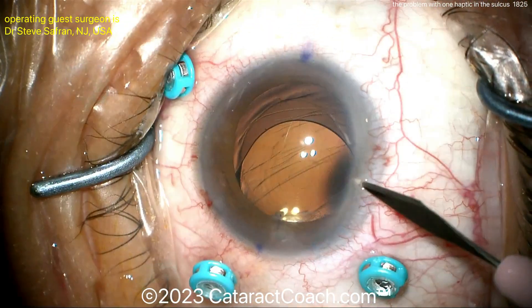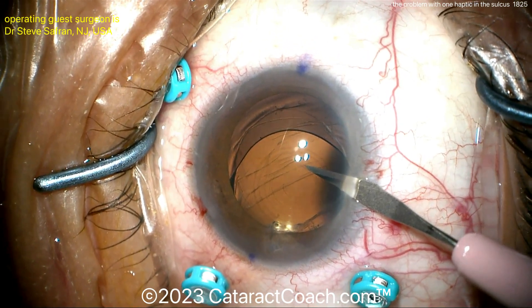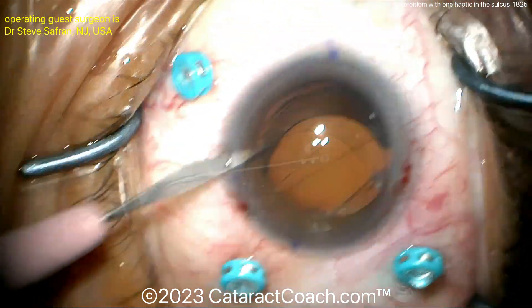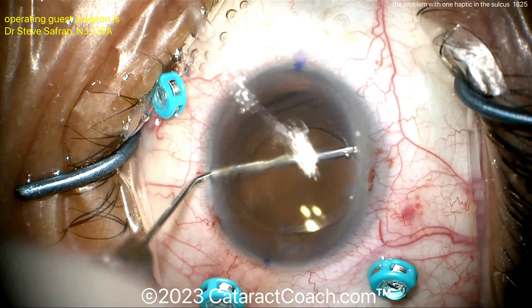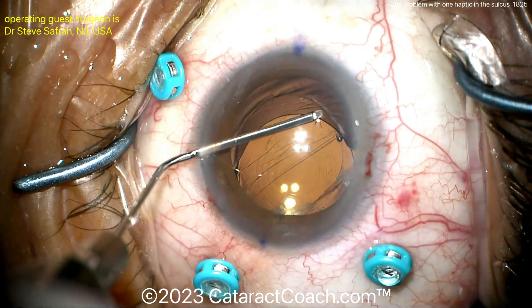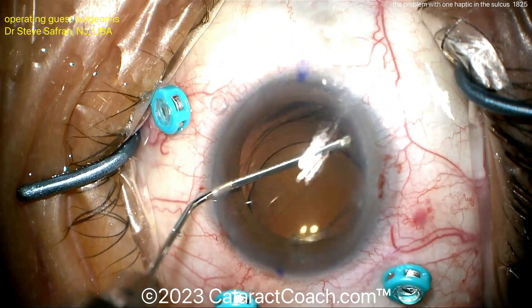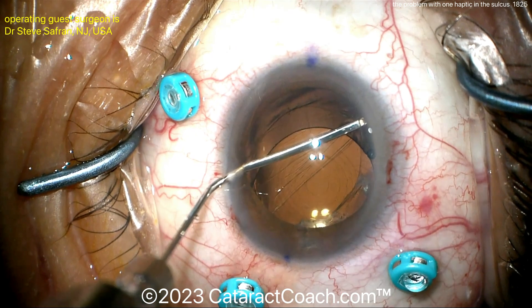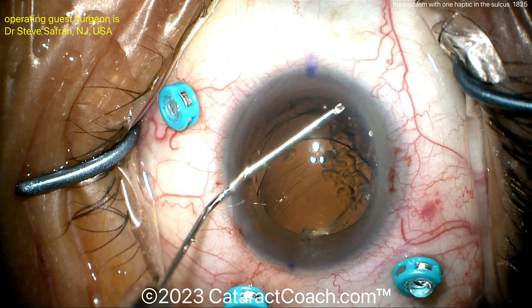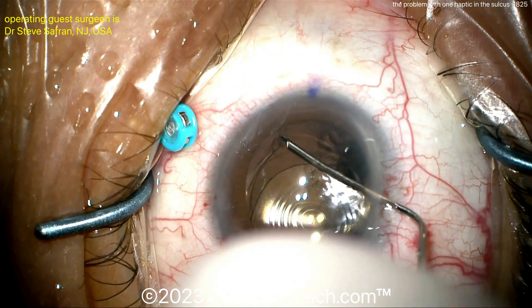There's obviously some prolapsed vitreous that needs to be cleaned up as well. Now the question is, if the patient wants the trifocal lens, can you rescue this? A couple of paracentesis incisions are being made inside the eye. Here's a LASIK cannula with some viscoelastic to get under that rhexis edge to separate the anterior and posterior capsule leaflets. You want to get that capsule bag opened to see if you can get that lens back in the bag. Even though the posterior capsule may be open, there could be great support at the equator.